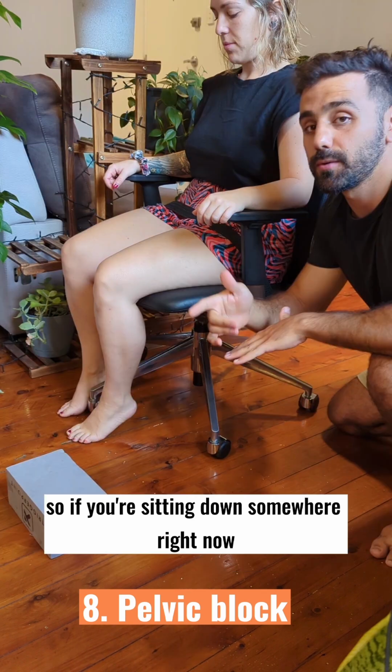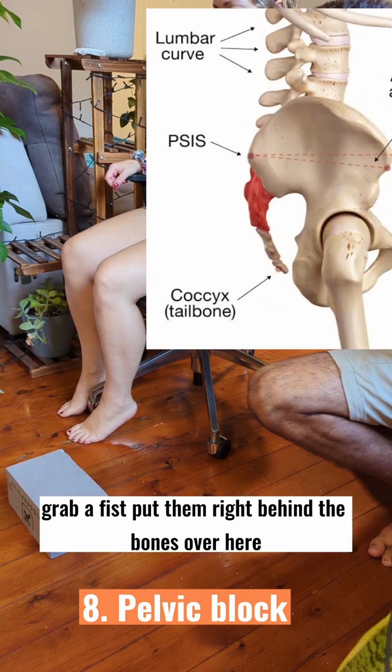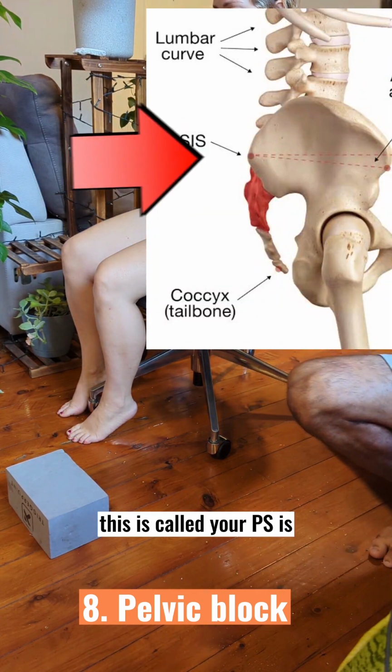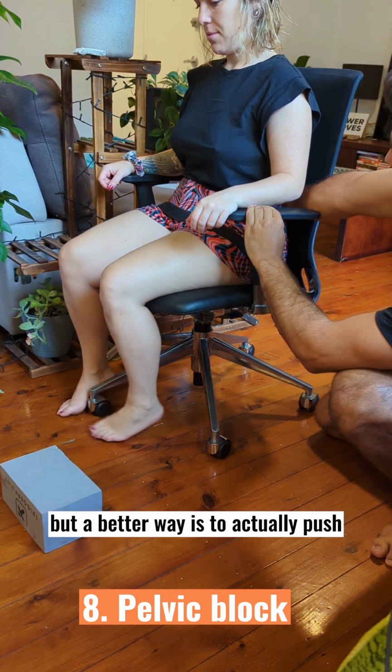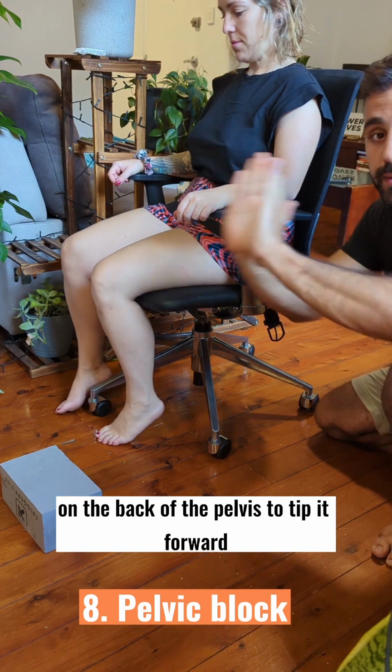Number 8, you want to use a pelvic block. So if you're sitting down somewhere right now, make a fist, put it right behind the bones over here. This is called your PSIS. So often people think lumbar support is a great way to stop a posterior tilt, but a better way is to actually push on the back of the pelvis to tip it forward.